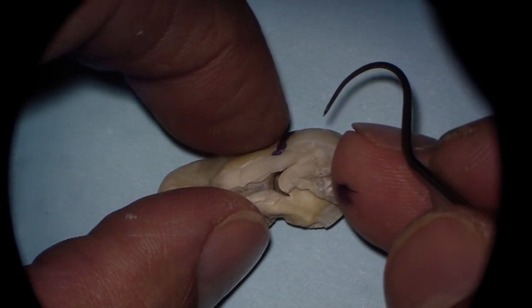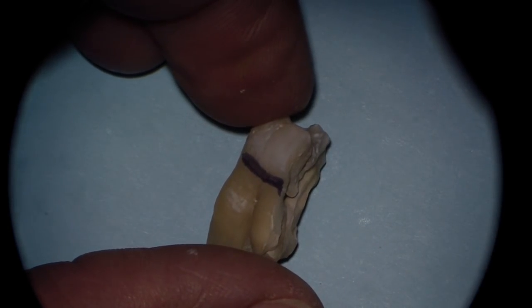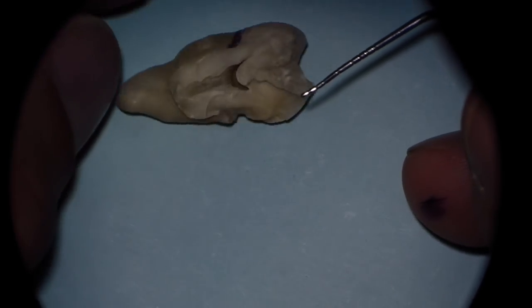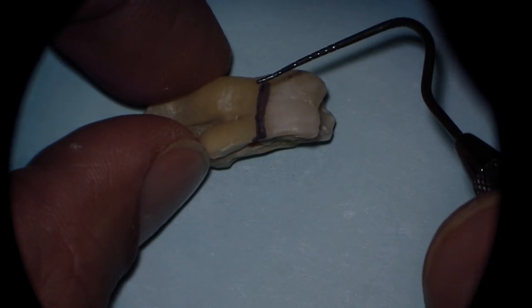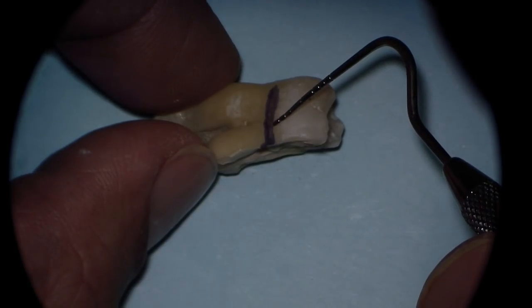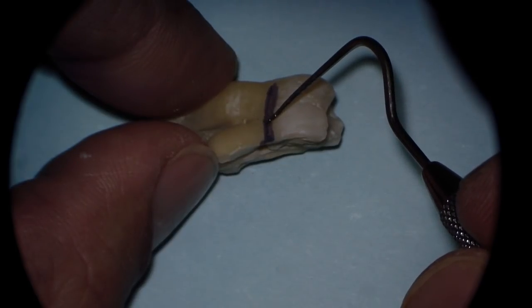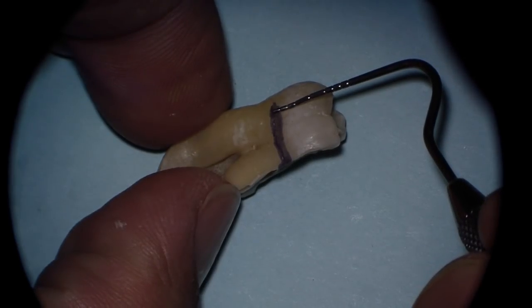So if you probe — even before you start your access, because normally we don't access on virgin teeth to do endodontics — if you can find the CEJ and determine where it is, you can measure from there. You can measure from the CEJ to one of the cusp tips.